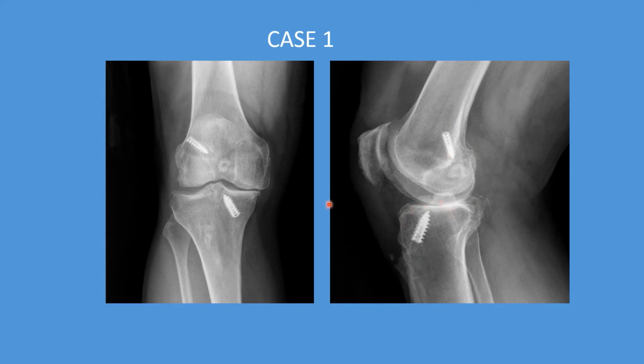So this tibial screw is what we call anterior medial. This screw is what we call posterior lateral, because these screws are in a three-dimensional position within the bone. So we need to know how we're going to approach the knee replacement, and specifically the position of these screws in relation to an implant that we hope to place. I'll show you how we do that.